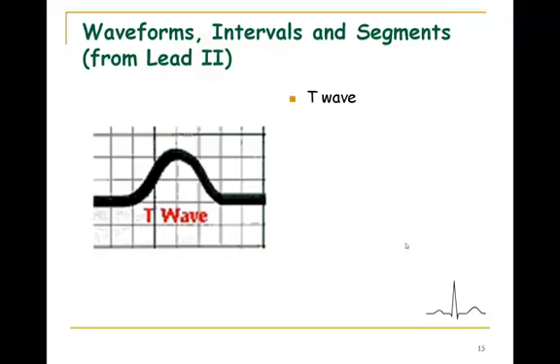However, for example, something like severe hypertrophy. If something is taking way too long to depolarize, because you've got a lot more muscle mass, the fibers that were near the endocardium, that may have been depolarized already, are waiting while some muscle fibers way down the line are still depolarizing. They can come out of their refractory period and then repolarize first. And so what happens is the T wave will then be inverted.